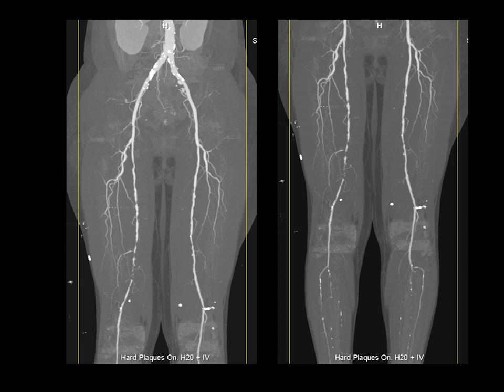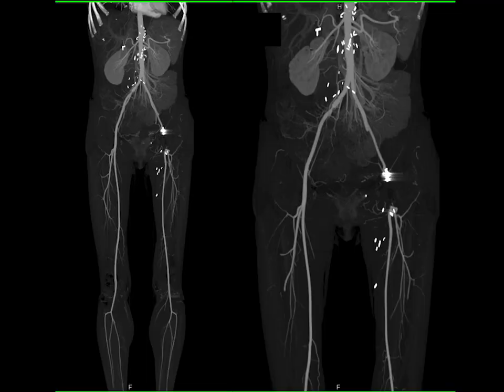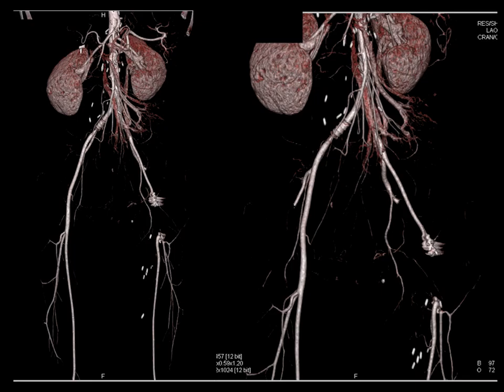And here you can see the bone removal and the diseased SFA and patients' popliteal arteries and trifurcation vessels. Here's an example of an occlusion of the left iliac artery, very nicely shown there. Again, the bone removal speeds up the process. The technologist could do the bone removal for you, and then you simply go into the data set and can analyze the images very nicely.